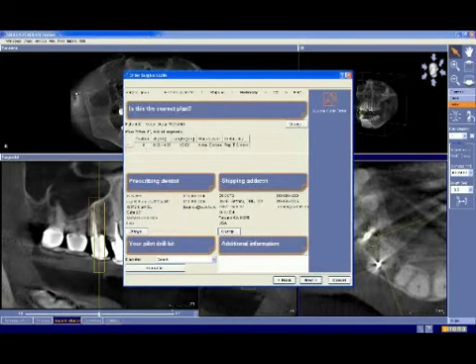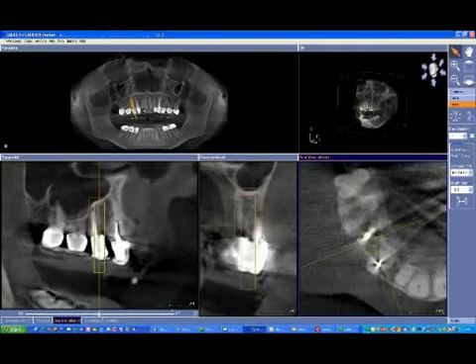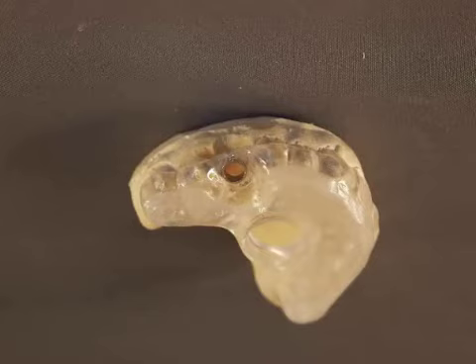Then we go to our implant ordering screen, where with just a couple of mouse clicks we're able to take the data from the implant planning and burn that into a CD, which is sent along with the study models and the radiographic template to Sirona in Germany, where the radiographic template is actually converted into the drilling template. And so here is the surgical template or drill guide, and the turnaround time for this is approximately 5 to 10 working days, and that's for it to be picked up in my office, FedEx to Germany, the drilling guide to be manufactured, and then returned back to my office. So the turnaround time is actually pretty good.